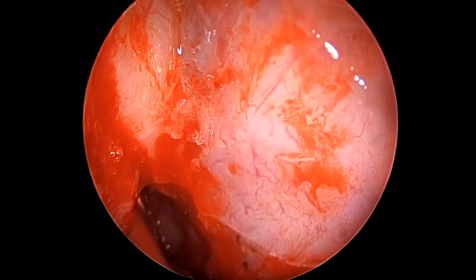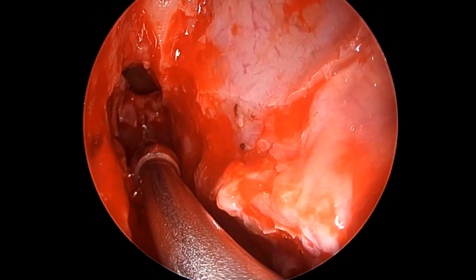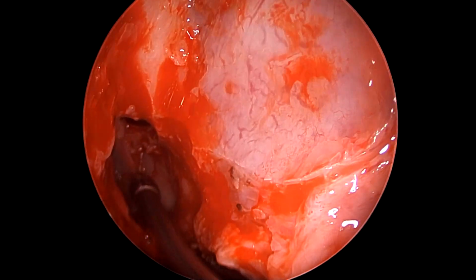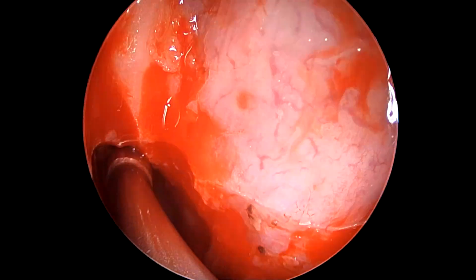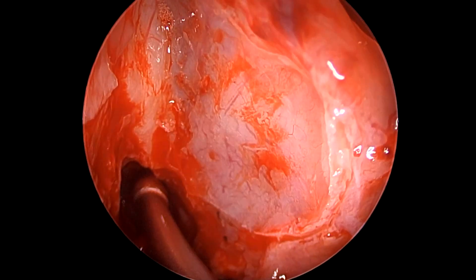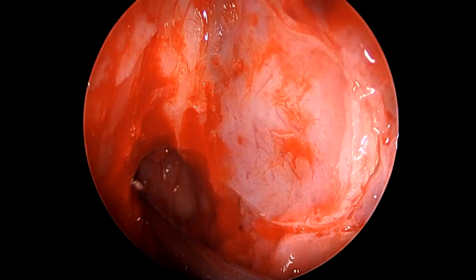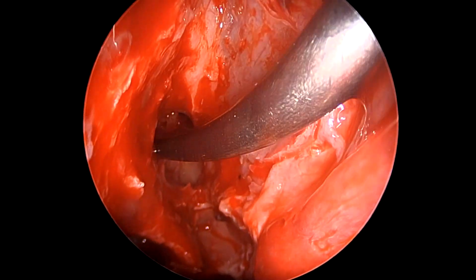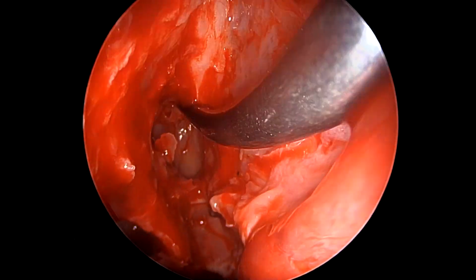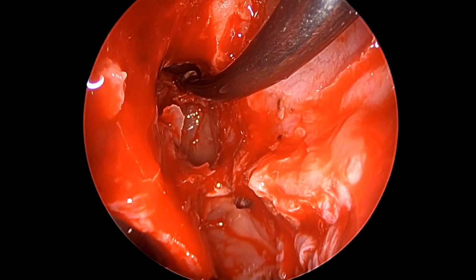So just to revise the anatomy, the most anterior part of it is now the frontal sinus that lies just above the beak, and posterior to it are the T3 cells.